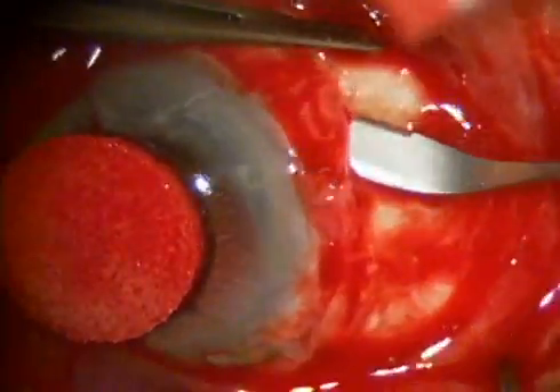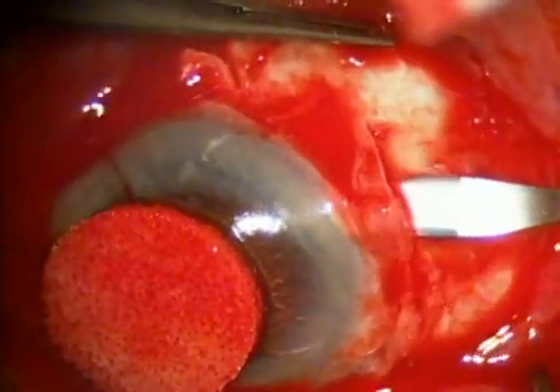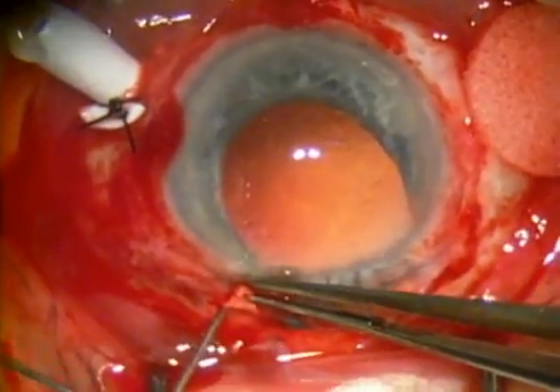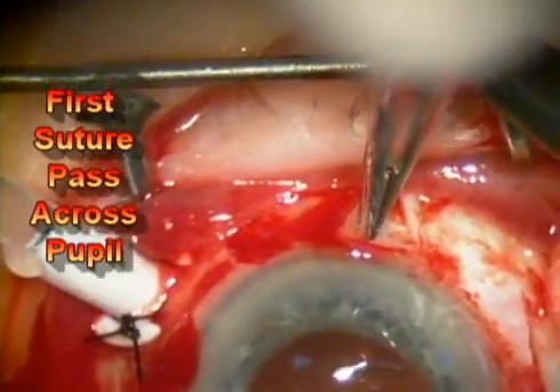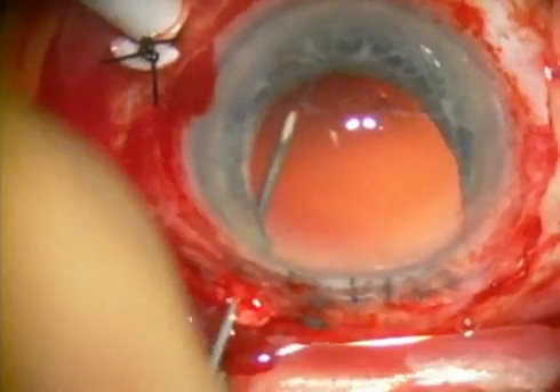On the right of the screen, you see a scleral flap being made for future insertion of the posterior chamber intraocular lens. On the lower part of the screen, a 27-gauge needle is inserted, and then here on the top of the screen, the suture needle is inserted into the eye.